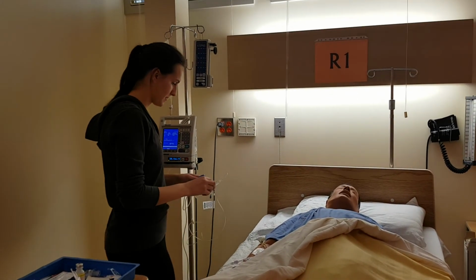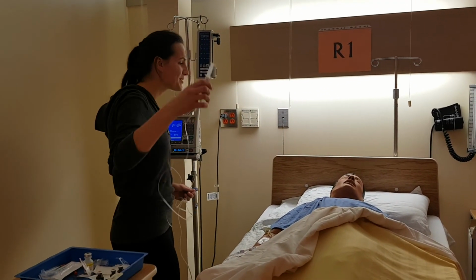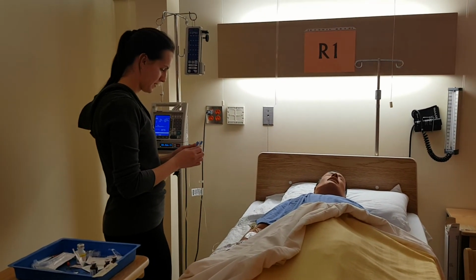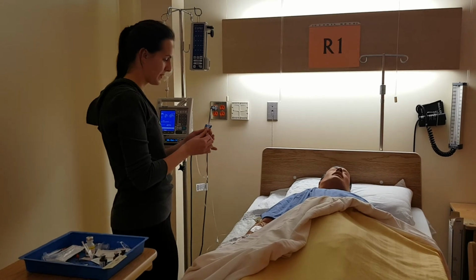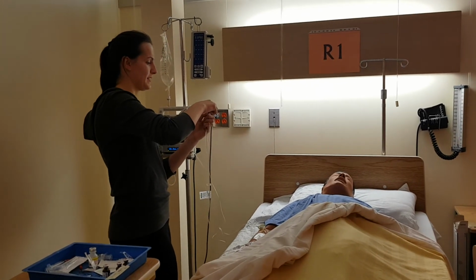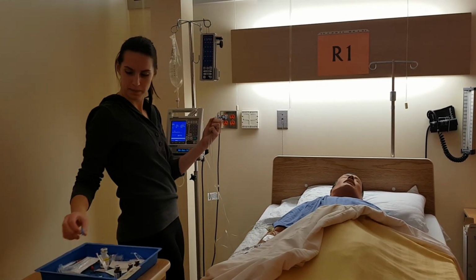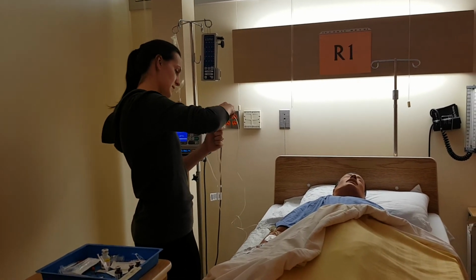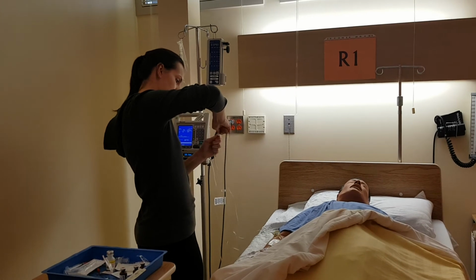Okay, and you have an allergy. So I'm just going to use your bed here to lift your syringe. It's dry and I'm being careful not to touch. Okay, so I'm just going to go do my third check now. So right patient, and we're reading the chart already.